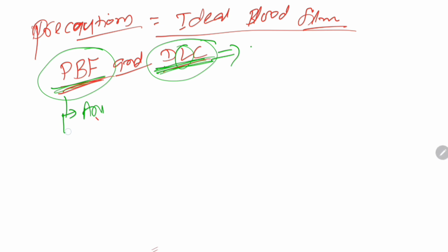Then we can also know about the platelet count, the relative count of platelets. Indirectly, we can count the comparative number with the RBCs. We can see the response of any chemotherapy on the RBCs. We can also detect cancer cells, different types of cancer cells, blood cancer especially.